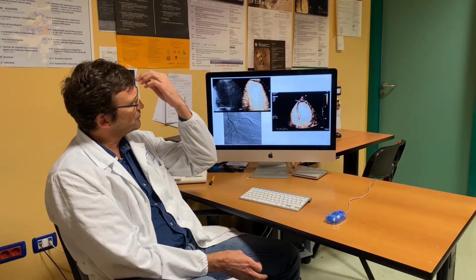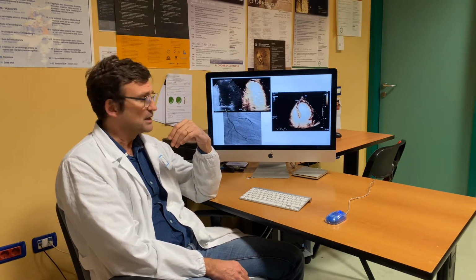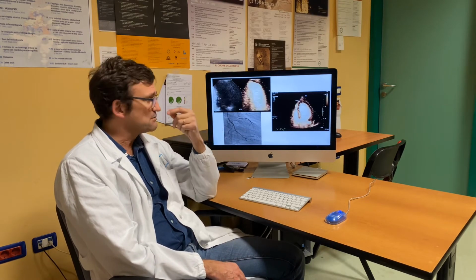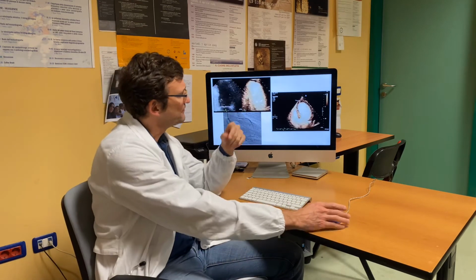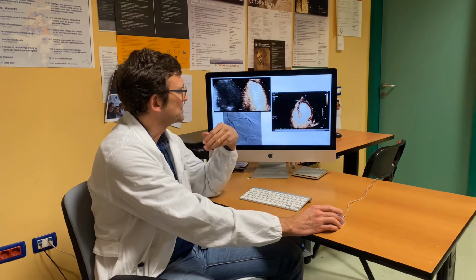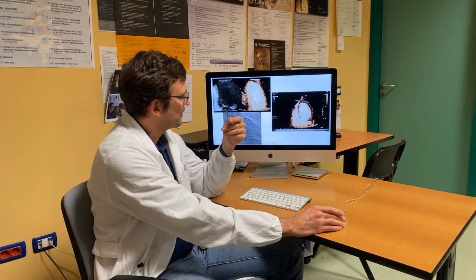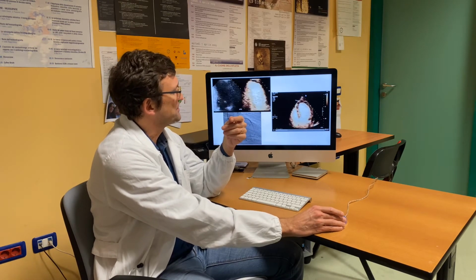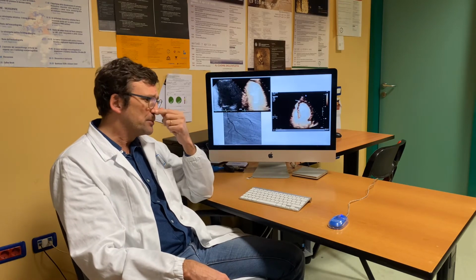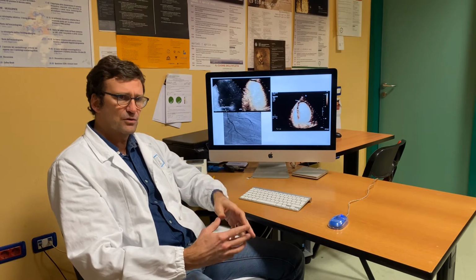Another case I prepared for you, Sergio, is a case of ST elevation MI, which was reperfused very rapidly, in just 30 minutes. But you can still find, using this incredible tracer, microbubbles, an incredible tracer of the microcirculation, that the artery is open here, but you have persisting microvasculature defects. So that's quite important. It's a pure tracer of the microvasculature, and so it helps a lot during echo.